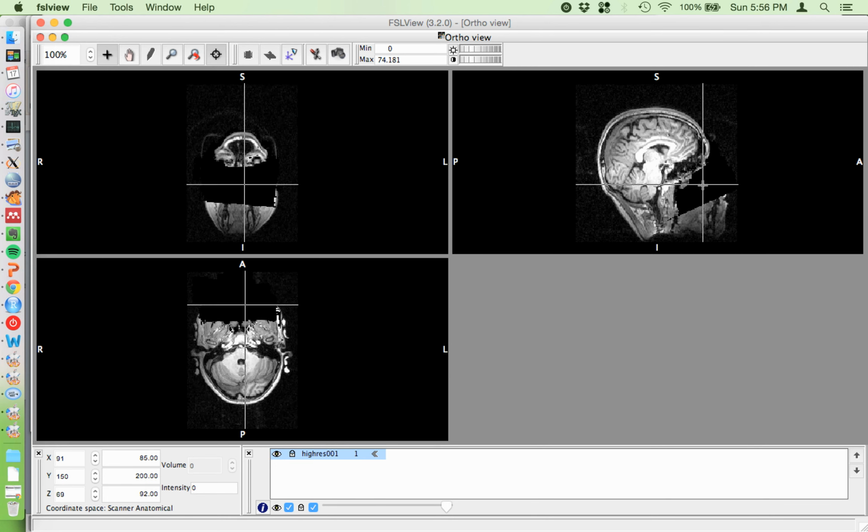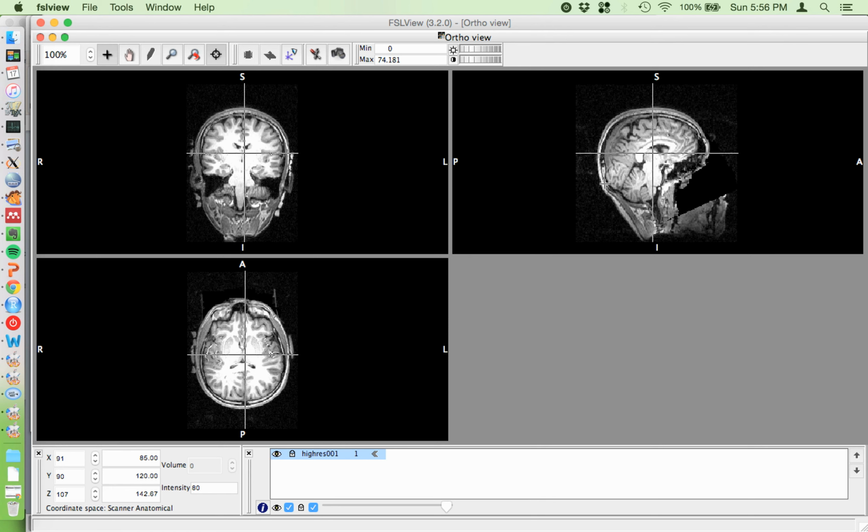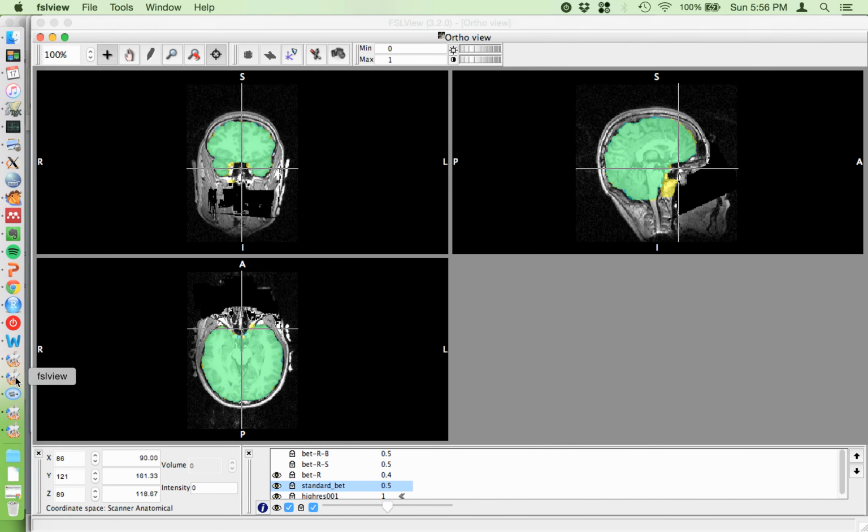It's okay the face is missing, it's supposed to be missing, but otherwise make sure these labels are correct and that the head is oriented just like this in the viewer. The face is facing to the right here, it's facing forward here, and left is on the right and right is on the left in this view.